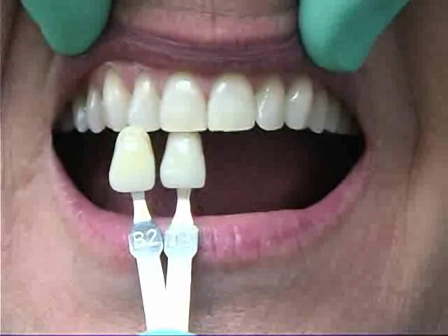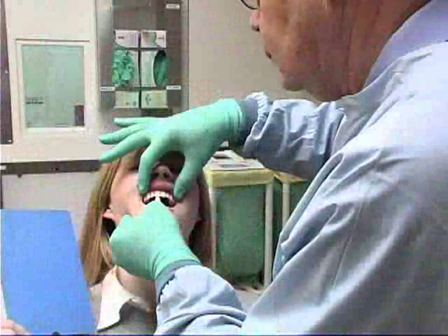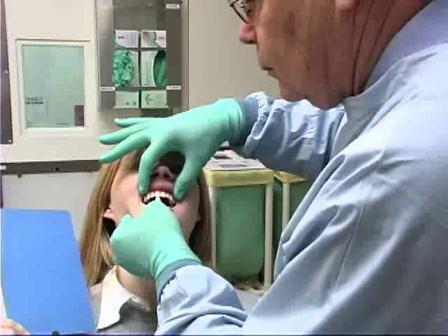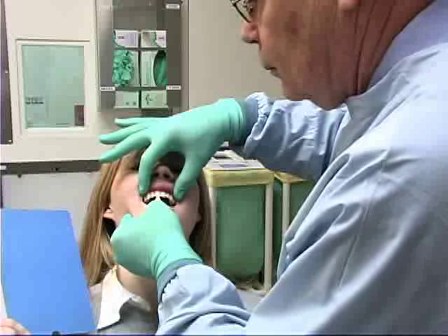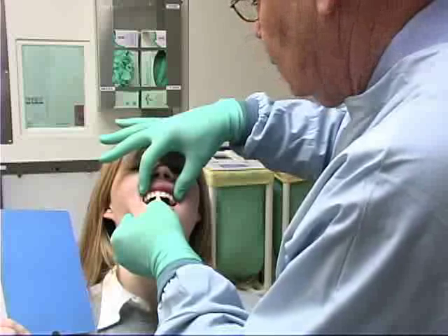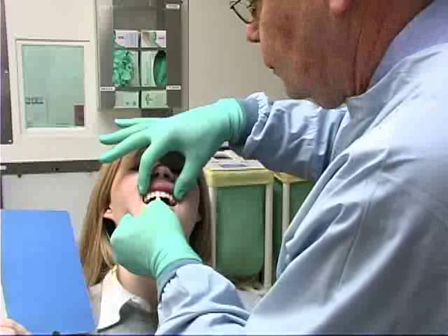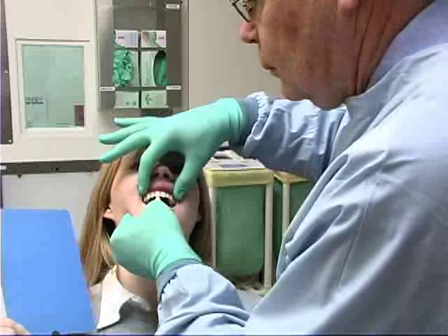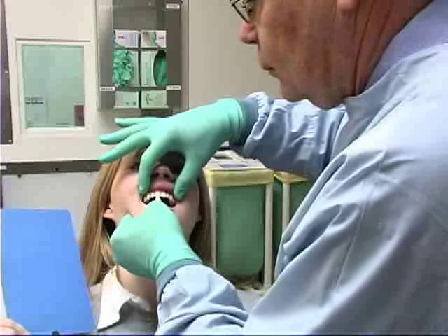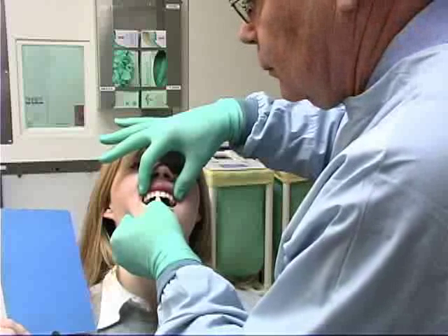Holding the specimens below multiple teeth may be helpful. During the color comparisons, short duration glances should be used. It is wise to look away from the mouth, focus on a distant object, and then look back for a short duration glance to gain your first impression as to the best color match. Looking away from the mouth and staring at a blue piece of paper or cardboard helps sensitize the eyes to the hues most commonly found in natural teeth.